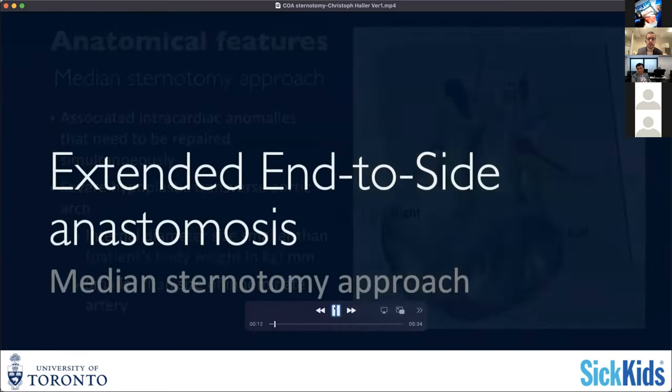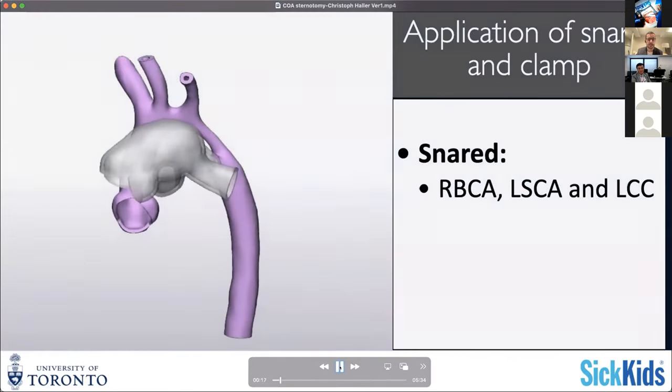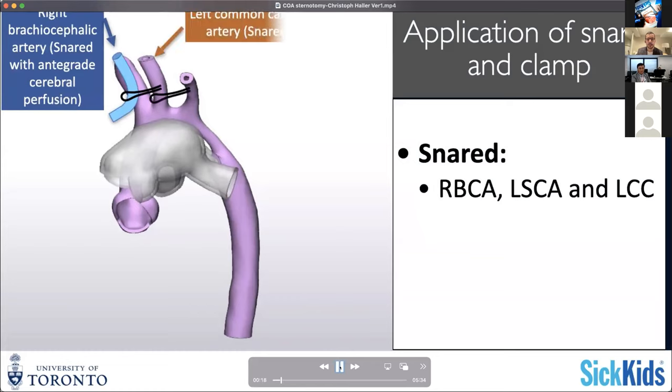Otherwise the anatomy is fairly similar. From a surgical perspective, the primary setup is that you're starting your procedure by putting the patient on pump and initiating cooling. Then you use the time while you're cooling to dissect everything out and get access to your supra-aortic branches and control them with snares usually.